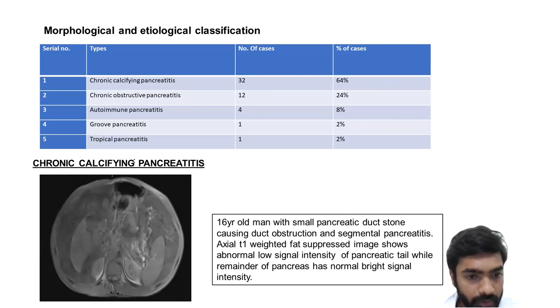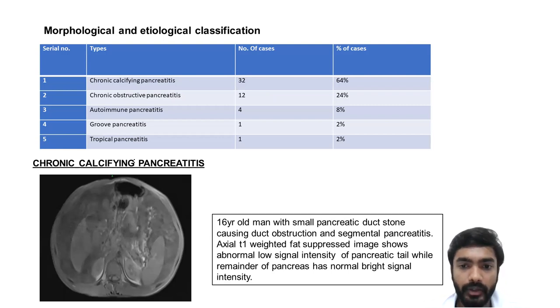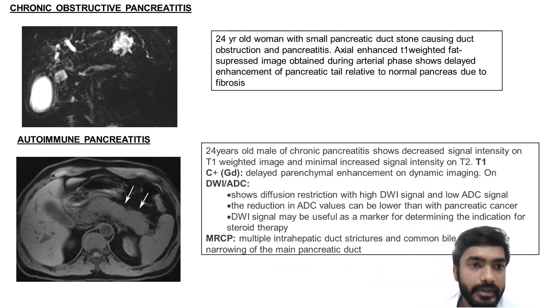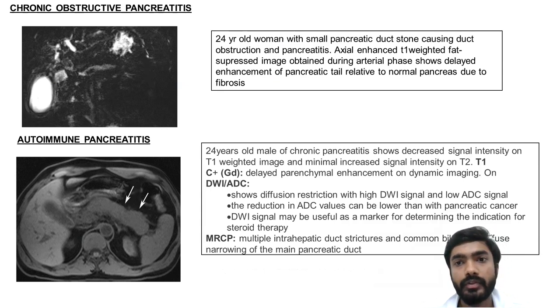Chronic calcifying pancreatitis: a case of a 16-year-old man with a small pancreatic duct stone causing duct obstruction and segmental pancreatitis — showing a tiny T1 hypointense area. Axial T1-weighted fat-suppressed image shows abnormal low signal intensity of the pancreatic tail, while the remainder of the pancreas has normal bright signal intensity. In chronic obstructive pancreatitis, a dilated pancreatic duct with an obstructing pancreatic stone was seen in a 24-year-old woman. Axial enhanced T1-weighted fat-suppressed image during arterial phase shows delayed enhancement of the pancreatic tail related to fibrosis.